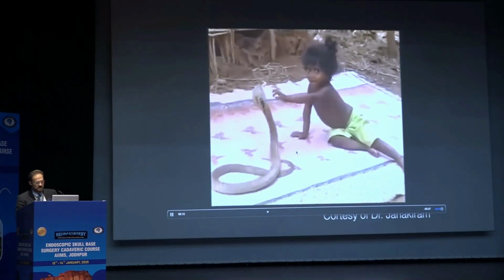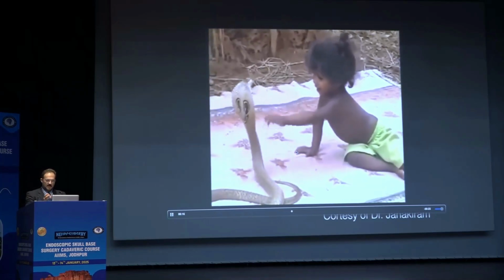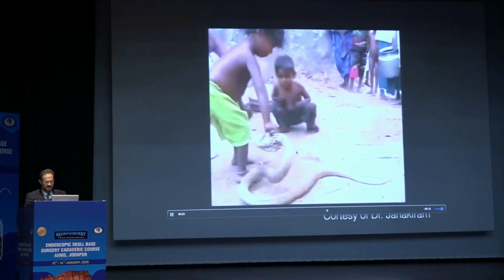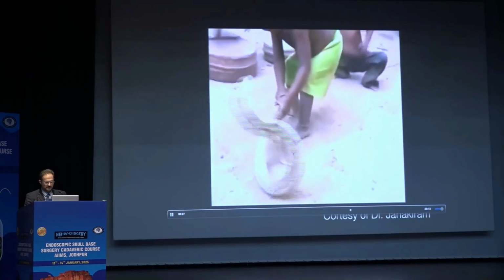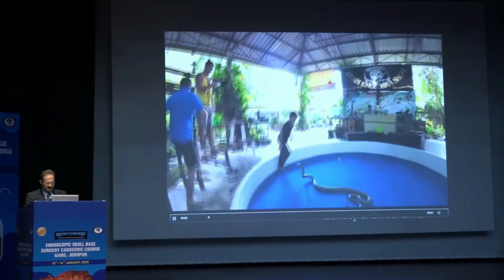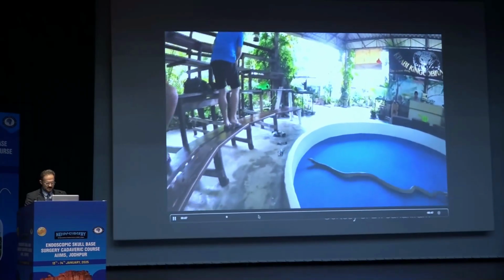And like what we are dealing with today, drilling, making the bone very thin, and then elevating the bone away from the carotid artery is very important, because you don't want to disrespect the cobras, and it may bite you. It may be problematic. You need to have a technique like this guy. Look at the technique. It's interesting.